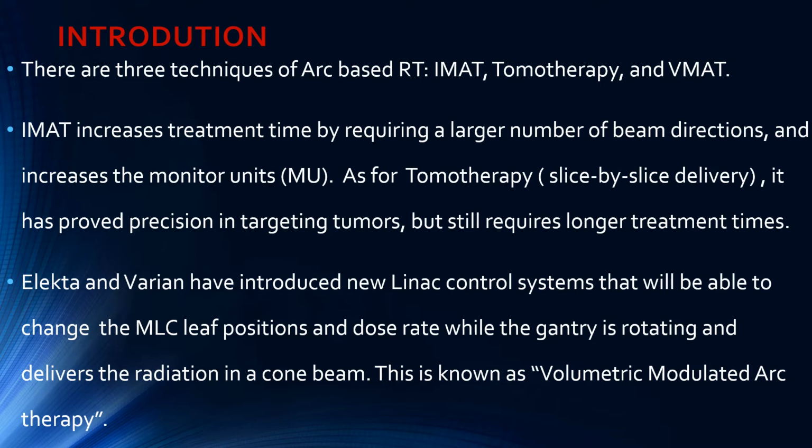Elekta and Varian, which are two control system companies, have introduced a new LINAC control system that will be able to change the MLC leafs, which are the multi-leaf collimators, positions, and the dose rate, which is the dose distribution per second, while the gantry is rotating and delivers the radiation in a cone beam. This is known as volumetric modulated arc therapy.